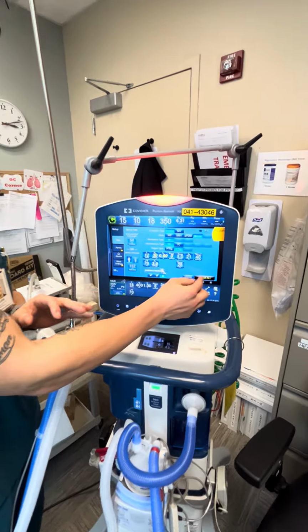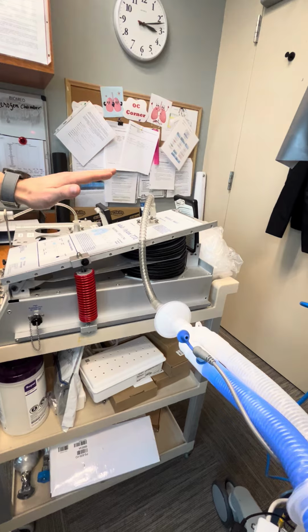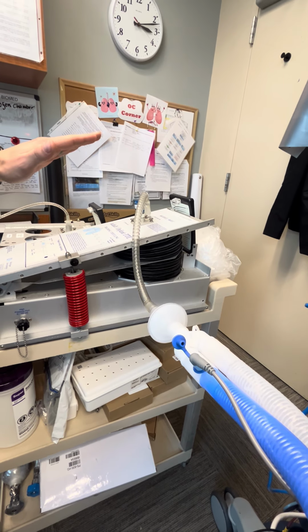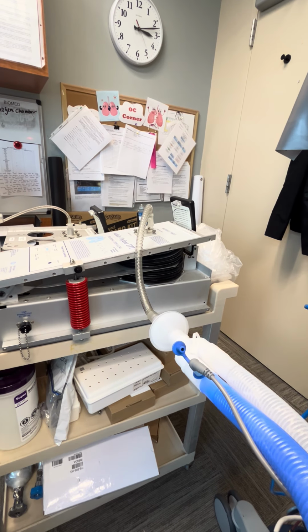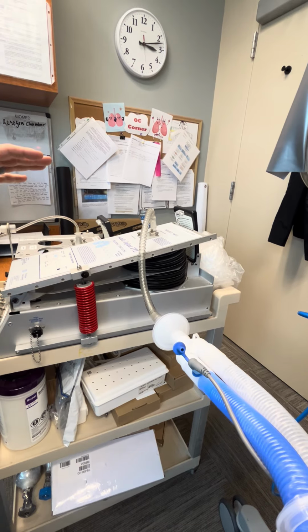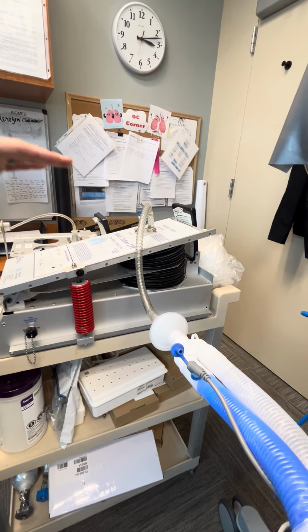Once you push accept, if you want to come over here and watch the lung, it's going to bring it up to that P high and then drop it down. So just by looking at this is what's going to be happening inside of your patient, okay? So once you switch over, you can look at your patient. You're going to see them inflate, holding them at that high T high time, and then we're going to drop them down.